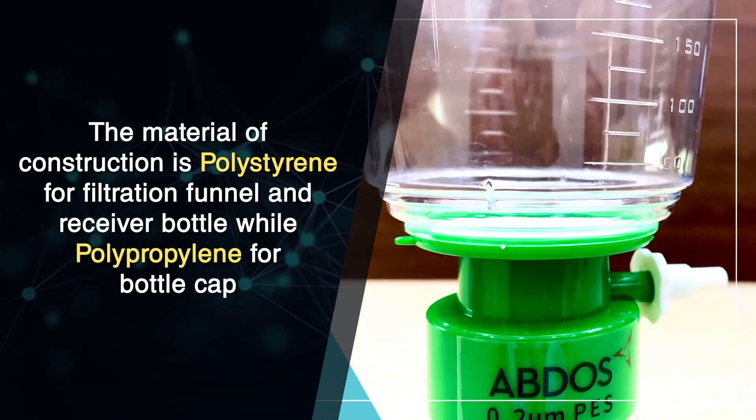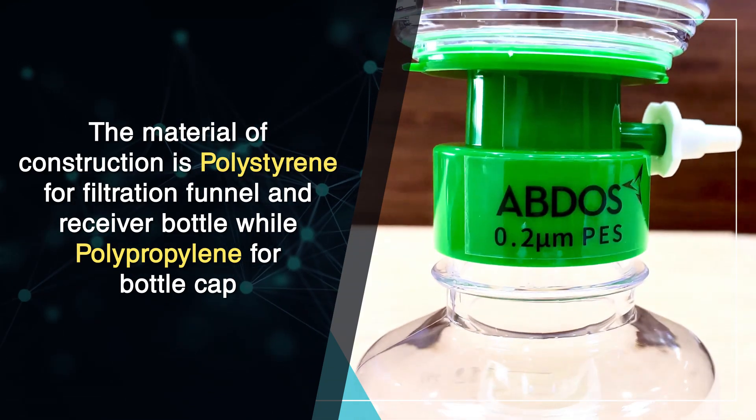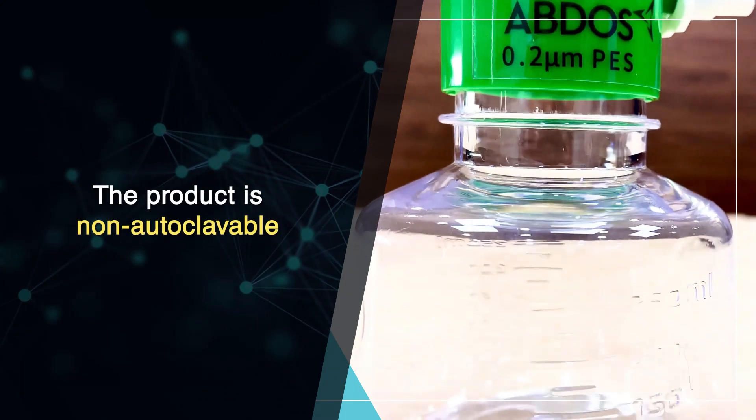The material of construction is polystyrene for the filtration funnel and receiver bottle, while polypropylene is used for the bottle cap. The product is non-autoclavable.